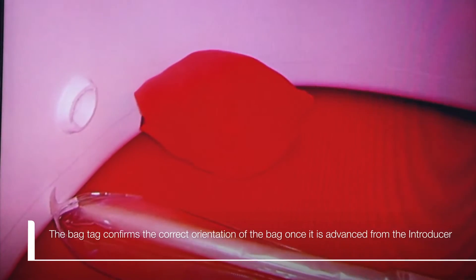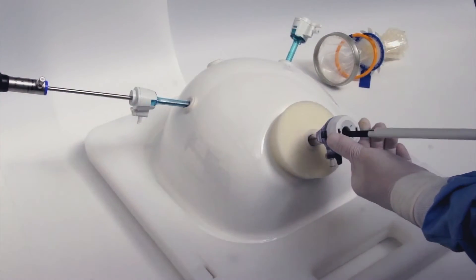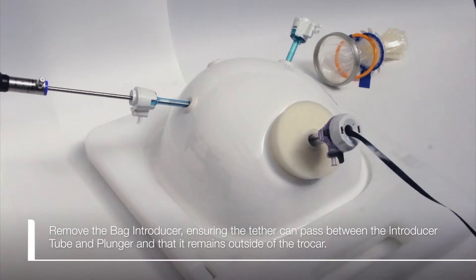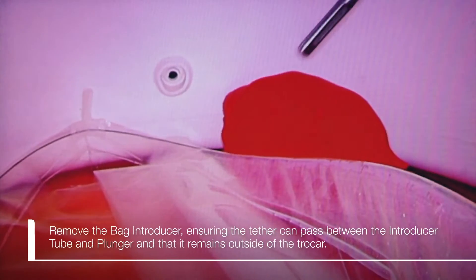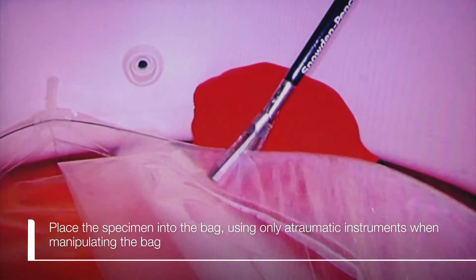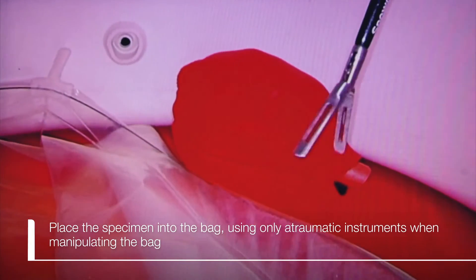The bag tab confirms the correct orientation of the bag once it is advanced from the introducer. Remove the bag introducer, ensuring the tether can pass between the introducer tube and plunger and that it remains outside of the trocar. Place the specimen into the bag using only atraumatic instruments when manipulating the bag.